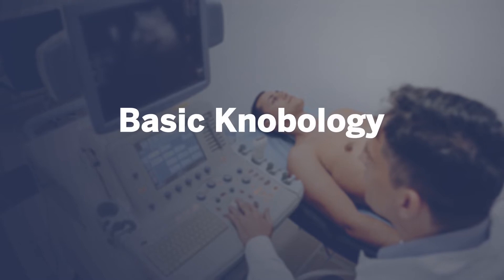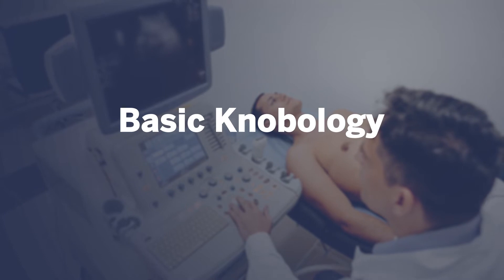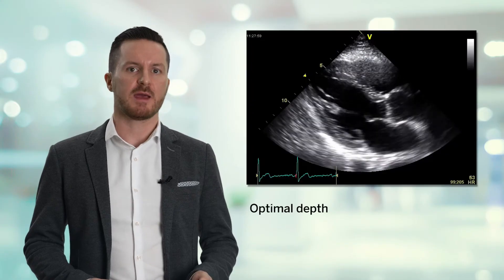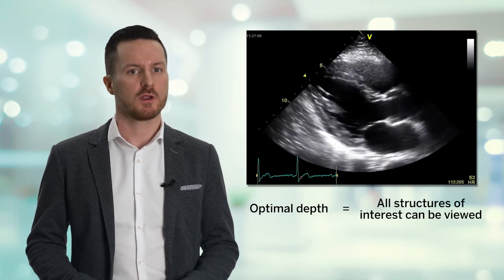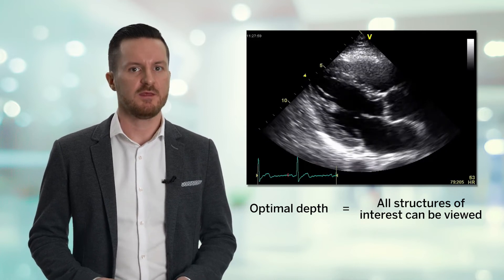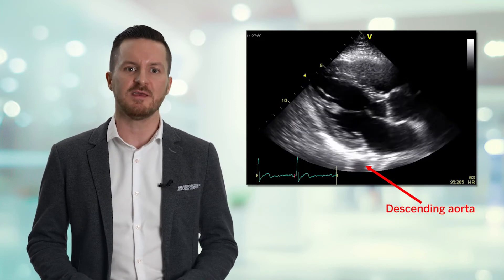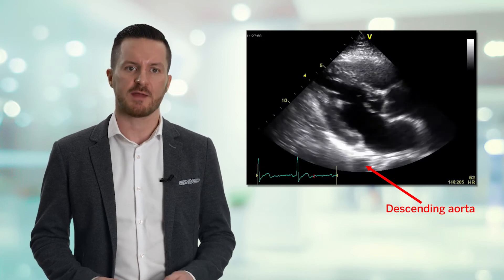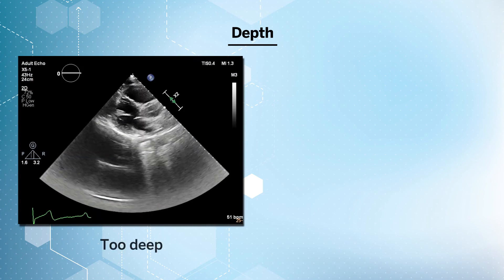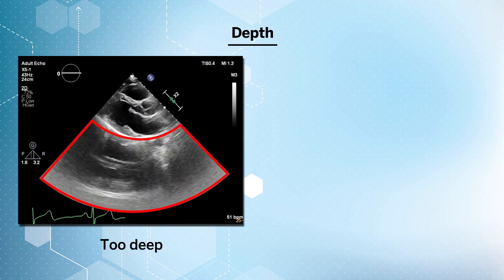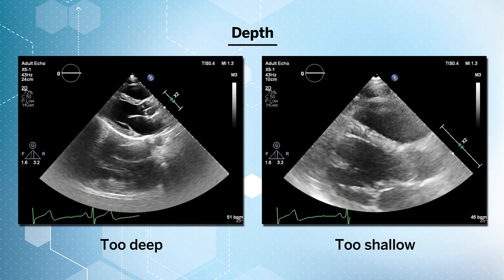In terms of basic knobology, there are two basic functions we need to be aware of on the ultrasound system in order to optimize our image. The optimal depth setting is when all structures of interest can be viewed on the screen — no more, no less. In this example, we have a parasternal long axis view and we can see that the descending aorta is the deepest structure of interest and is correctly located at the bottom of the screen. The image on the left shows that the imaging depth is too deep with a lot of wasted real estate in the far field, whereas the image on the right is too shallow and we are cutting off structures of interest.